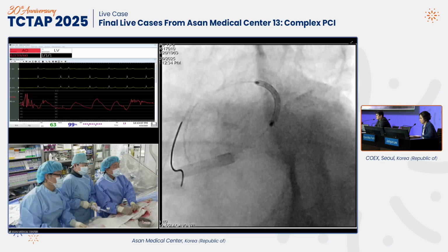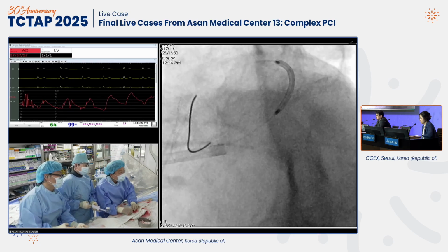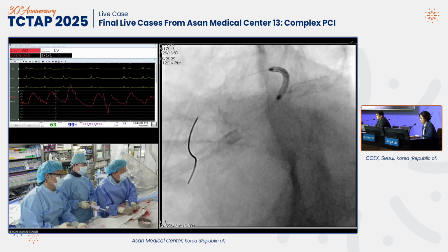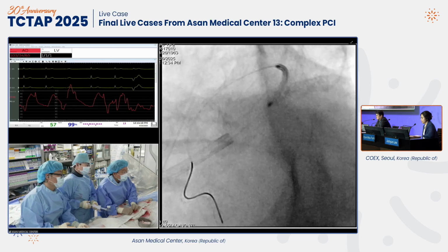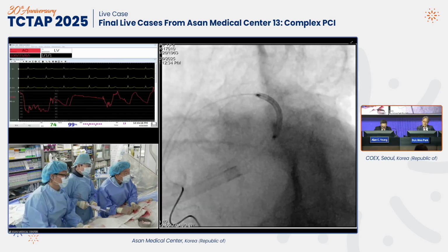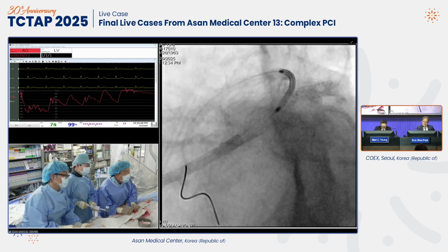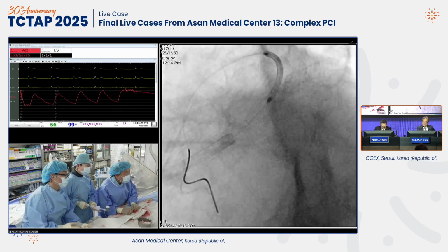I think it's okay for the mini crush. We have to cover the proximal stent area. Wire and test please. More stabilized. And I want to just confirm the proximal part would be covered. Test please. All right, 0.5 millimeters, push in, test.